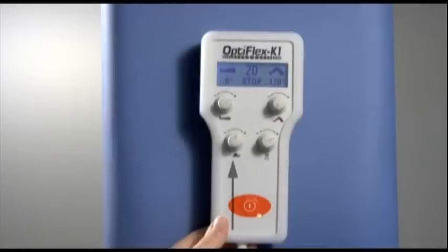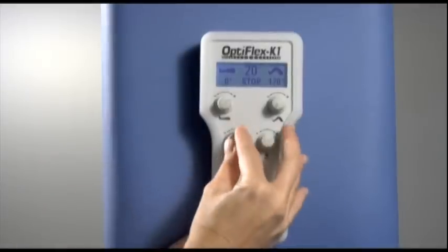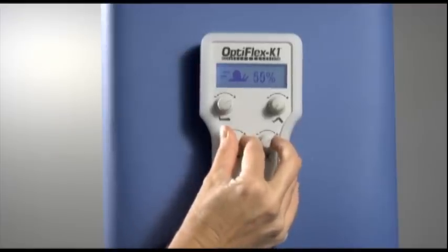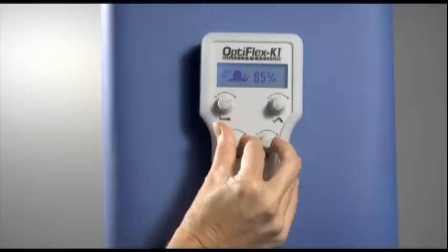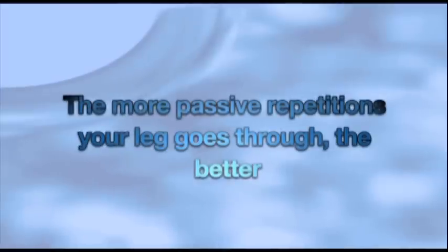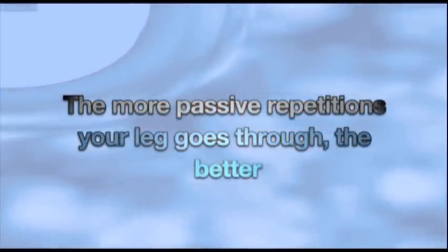To change the speed of the machine, use the knob symbolized by the picture of a snail. Push the speed knob in and turn in the appropriate direction, keeping in mind that this should be set at a comfortable speed for the patient. Remember, the more passive repetitions the knee goes through, the better.